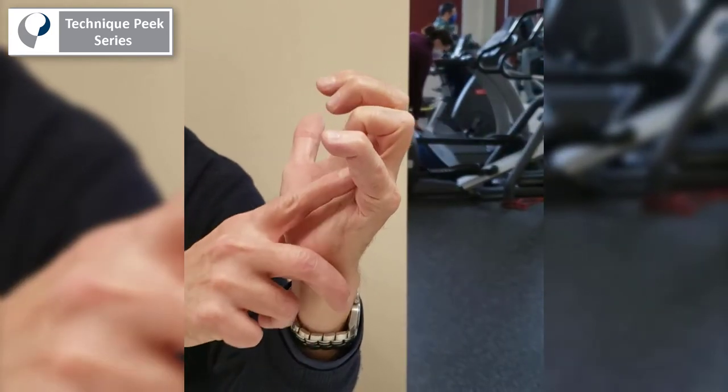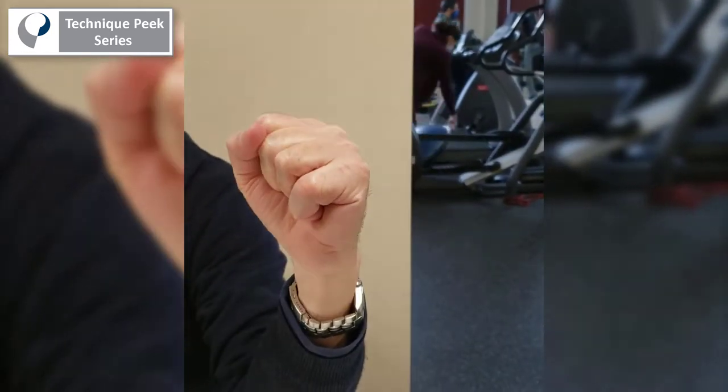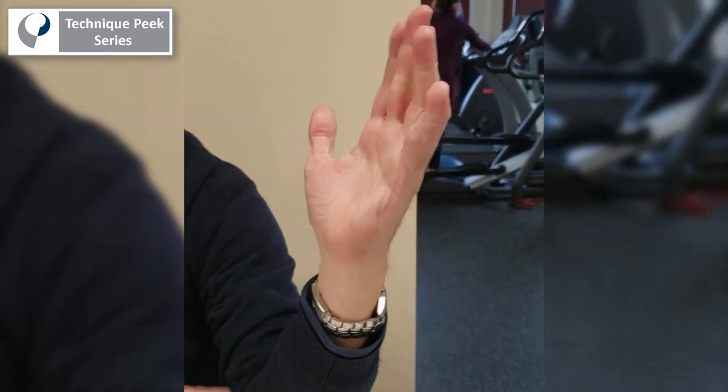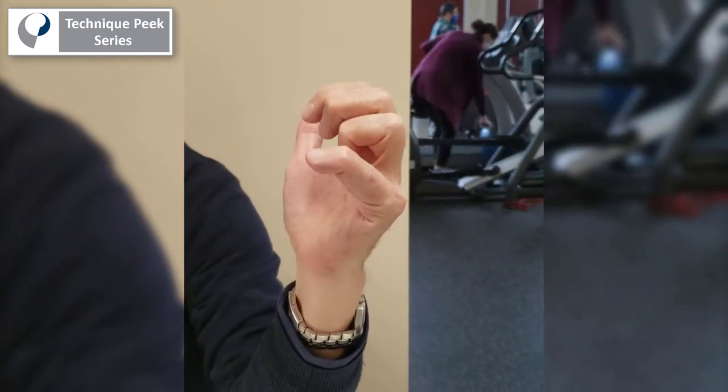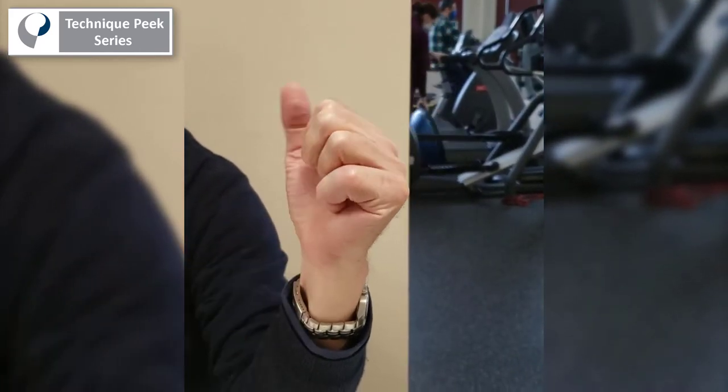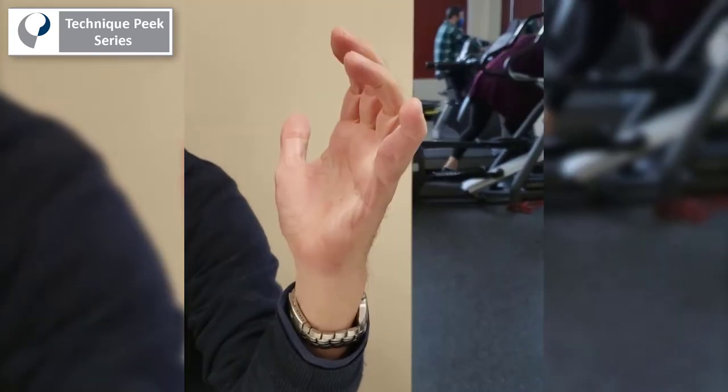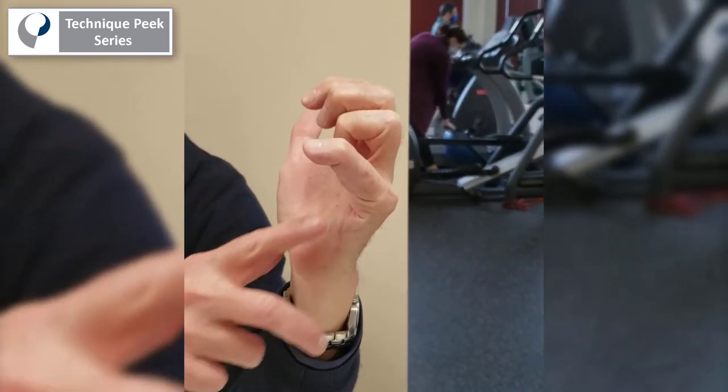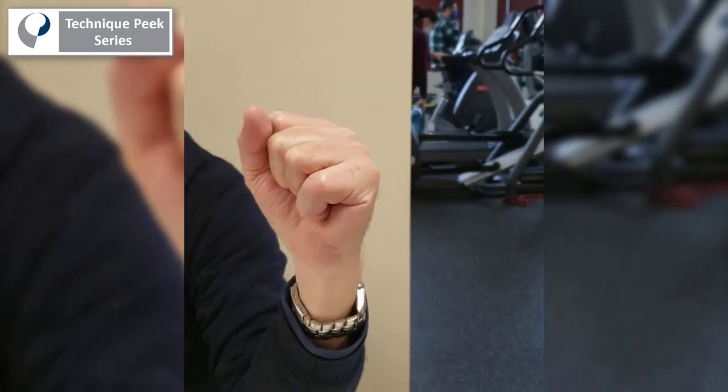This patient came in with a swan neck deformity after a PIP joint fracture dislocation. The most limiting factor for him was that he couldn't make a fist with active PIP joint flexion due to the hyperextension of his PIP joint.